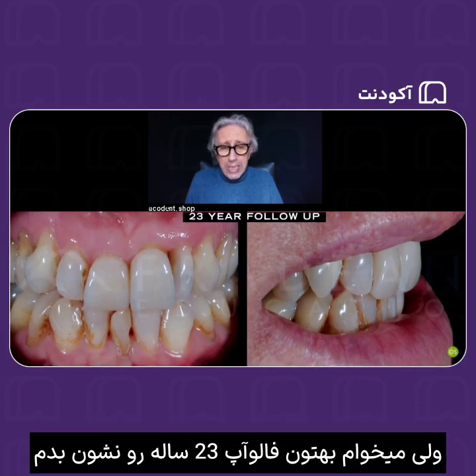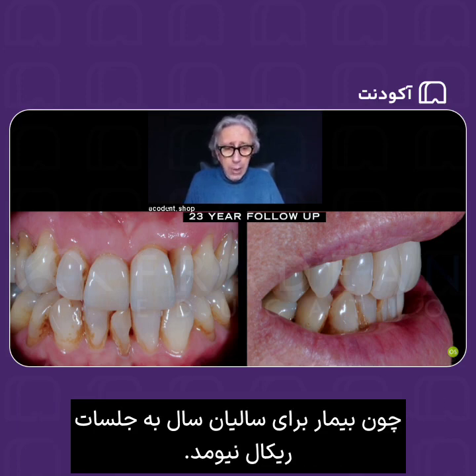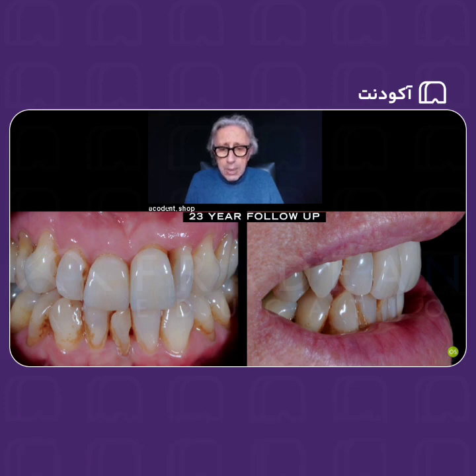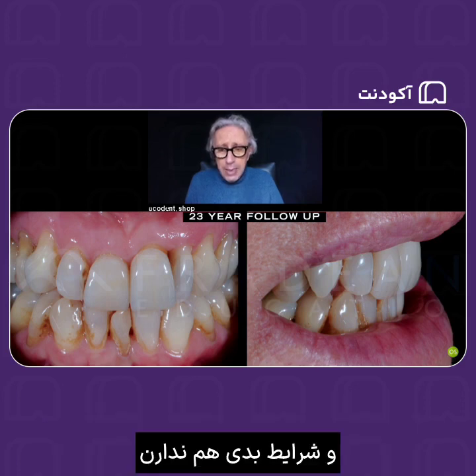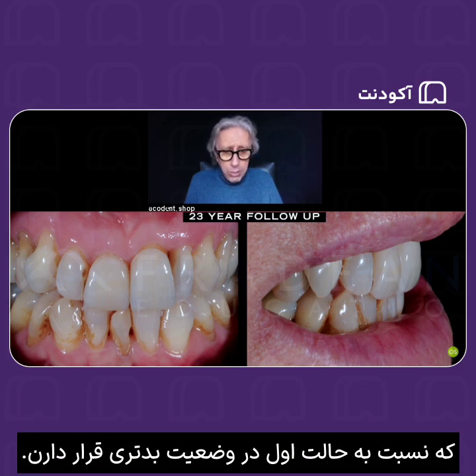But I want to show you the 23 years follow-up. At this point, even though you see the case altogether is not going so well because the patient doesn't show up for the oral hygiene recall for years and years, you see that we have just a little recession on the left central incisor that is not visible because, as you can see on the right side, the smile line of the patient is a low smile line. So, still, 23 years after, even though we selected a compromise solution, we can be happy because the two teeth are still there without any problem, and not in a bad situation, especially if you compare the other remaining teeth that are in a worse condition than before.